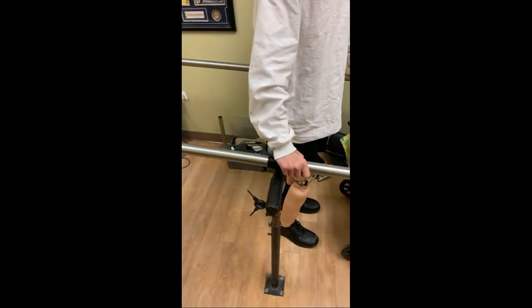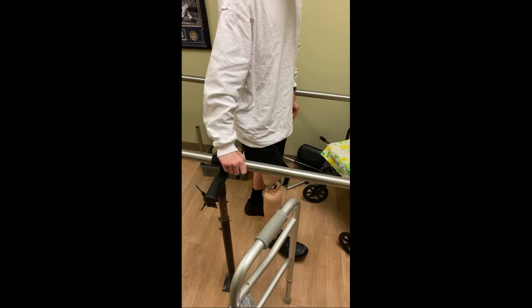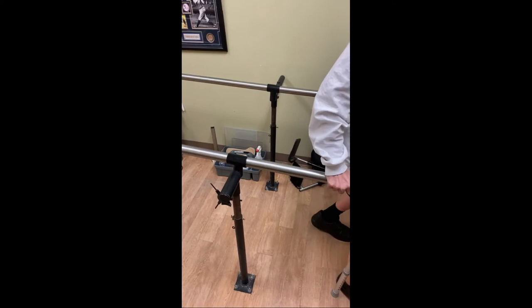It's the walker that's really the challenge — let me go get one. So you can see how I'm doing. Here we go with the walker. Is that my size? It might be a little wide. So let's come on out here. I'm going to jump in front of you here. Trust the leg — it'll hold you. Good.